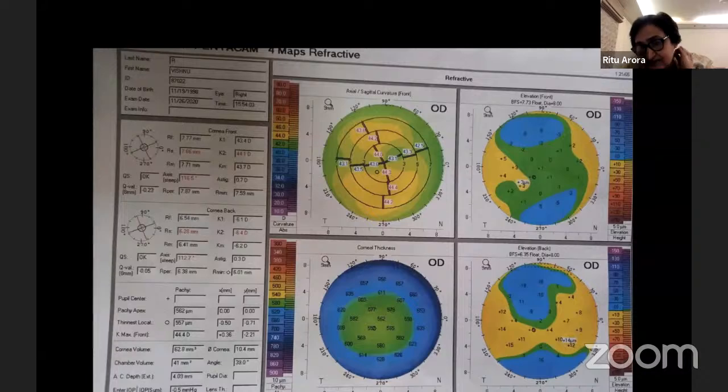And also what Dr. Anil talked about, that more than 8 microns becomes abnormal elevation. That is when the dia is 8 mm. Okay. And out here he's written best fit sphere 7.73 mm and best fit sphere elevation back is 6.35. So these are certain things which you have to see, and you cannot interchange from one to another. And also down below you will see it's written 0, 4, 8 like that. So it is telling you that within 2 millimeters of the cornea, 4 mm of the cornea, 6 mm of the cornea, like that, how the mapping is done.